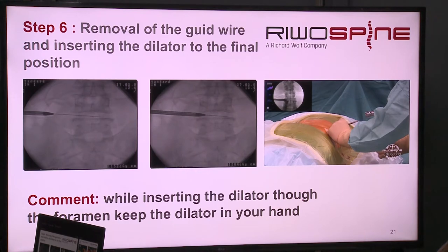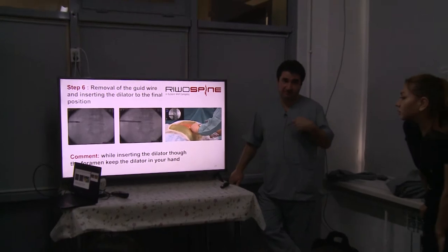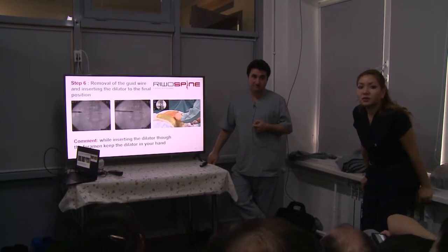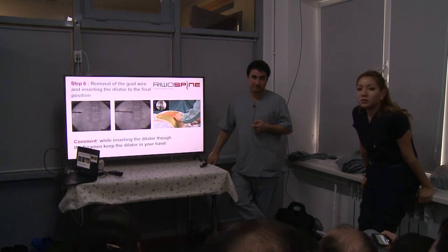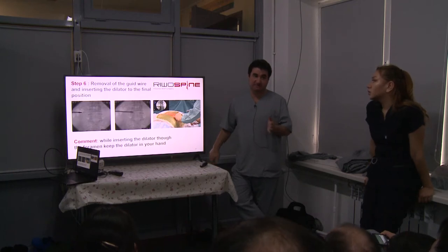They're asking about disc. Discs grow very minimum. Small. And there is a stenosis. Again, the same discussion. If there is a stenosis, then we prefer interlaminar approach. They're asking if there's a disc collapse and foramen. It means that it is foramen stenosis, yes, due to the disc collapse.